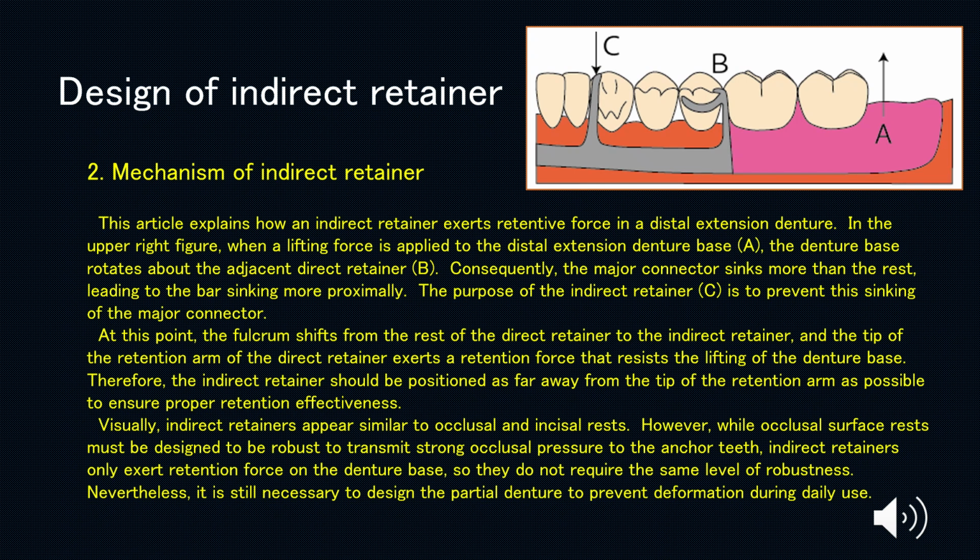Nevertheless, it is still necessary to design the partial denture to prevent deformation during daily use.